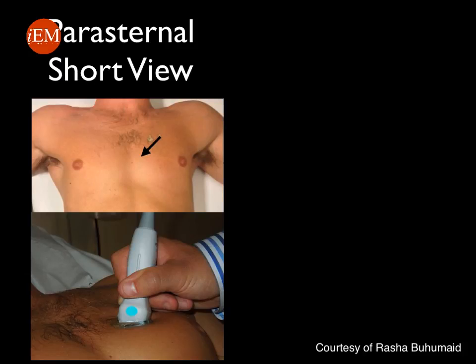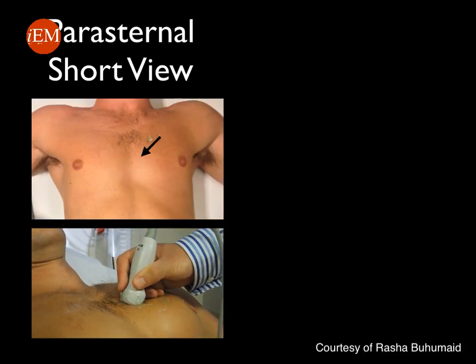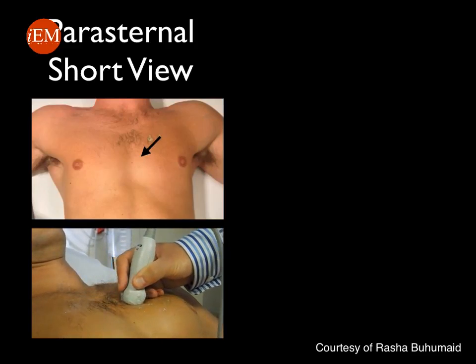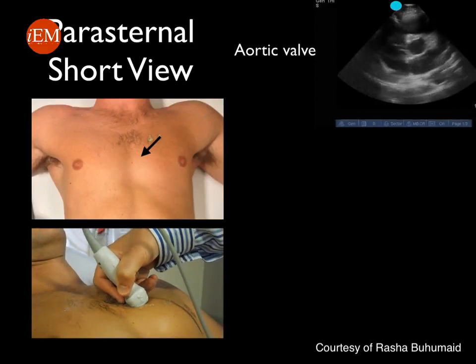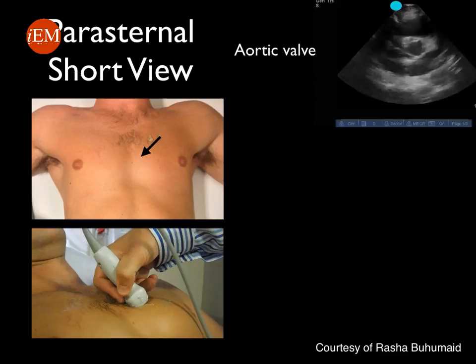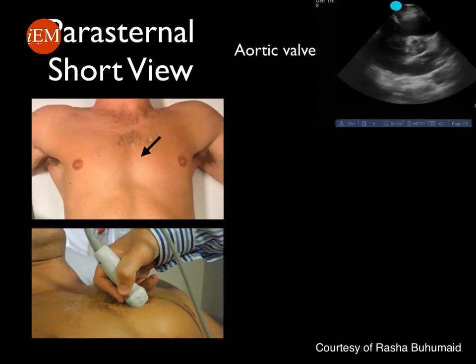The image you're going to obtain depends on the angle of your probe. Note here the sonographer is angling or tilting the probe towards the patient's right shoulder and then towards the apex. This will produce different images. If you're angling or tilting the probe towards the shoulder, you will be at the level of the aortic valve, and you will obtain what is known as the Mercedes-Benz sign, demonstrated in this ultrasound video.